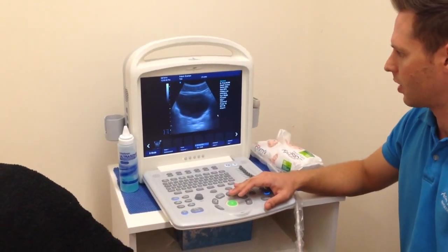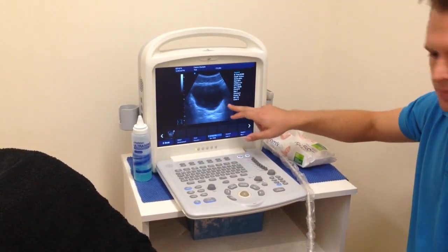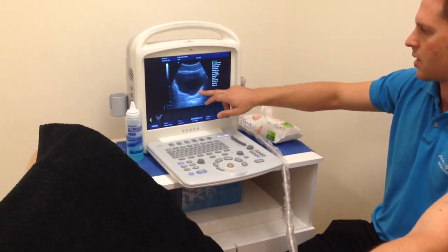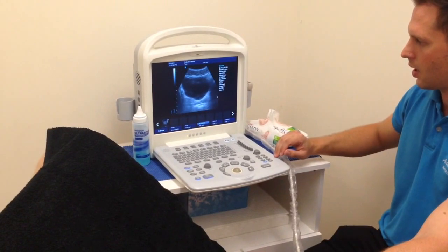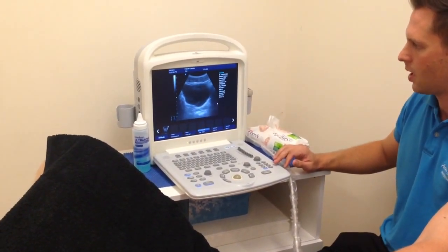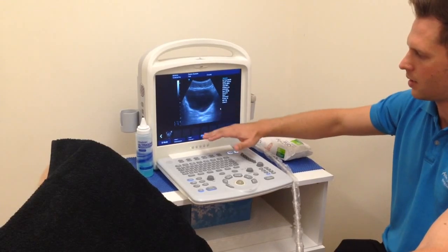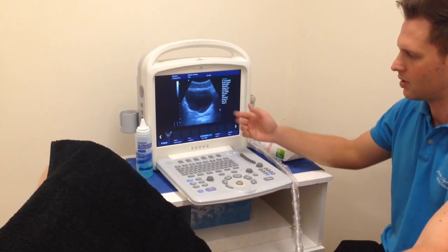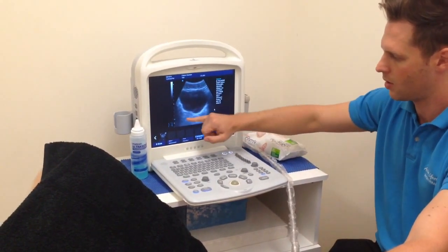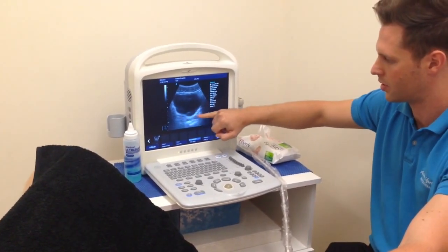What we're going to look at quickly is the image as a whole — we're looking for symmetry here. For Ben, we can see a little bit of a drop down on the right side compared to the left side, which may correlate with one-sided issues the patient may be having. What we're looking for is Ben's ability to control the descent of the bladder by contracting the pelvic floor muscles — it's an indirect measure of pelvic floor strength; we're not actually visualising the pelvic floor muscles themselves, only the base of the bladder.